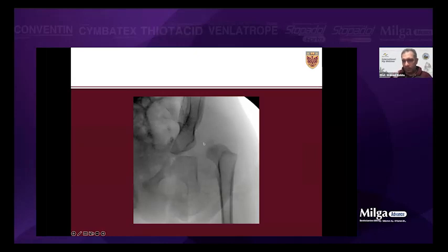I hold the ligamentum teres with a Kocher from the head, and I cut it with a knife. Again, don't injure the femur head. While holding it, I put my finger sliding parallel to it. This will be my guide to the true acetabulum. Then I use a long curved Mayo to cut it very deep. I go with the long curved Mayo parallel to it until I go inside the acetabulum and hit the bone. And with the curve, I cut the ligamentum teres.